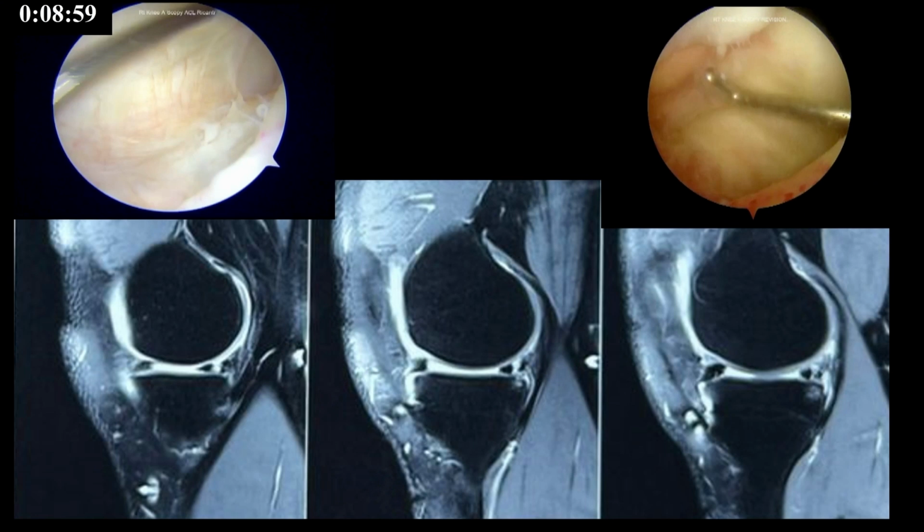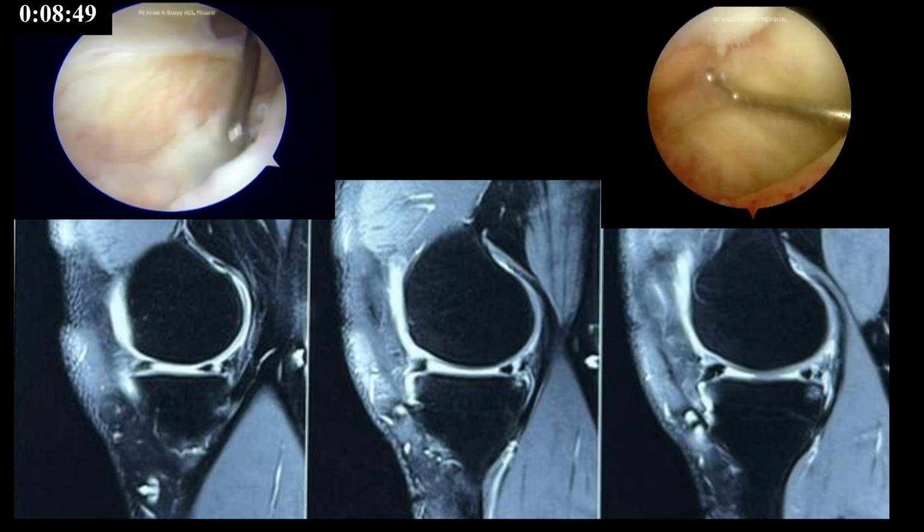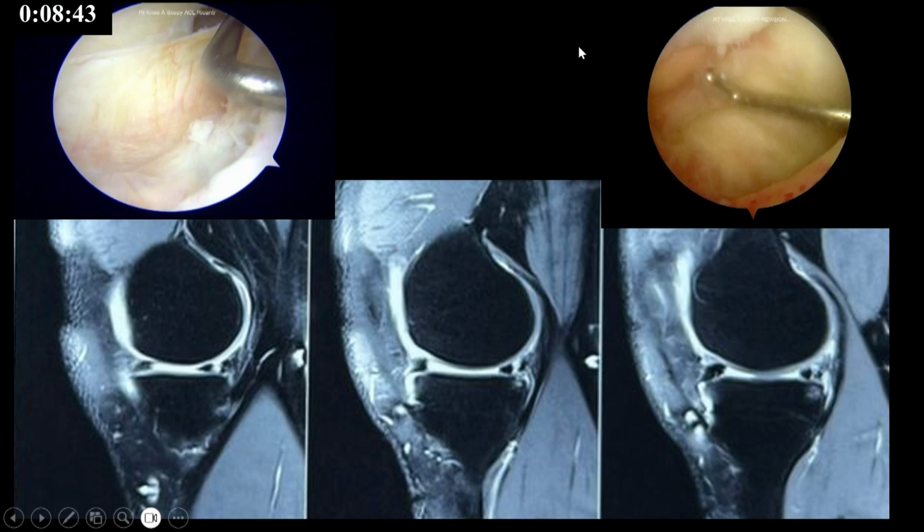So we also confirmed this by a patient where we received this patient. This is the initial ramp injury, which was treated 5 years ago with the same technique. This patient also had an ACL tear, and this patient came back to us in last month with a re-tear of the ACL. Now you can see here, that is the bucket handle tear of the medial meniscus. So there was a re-tear ACL, bucket of the medial meniscus, and if you see the posterior structures, that is our repaired ramp. This is our suture anchor which was placed here.